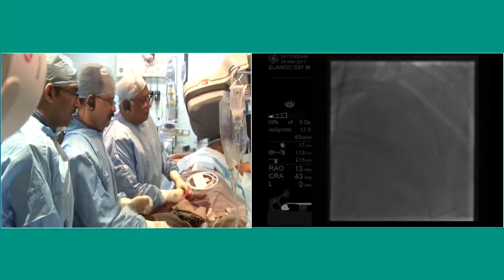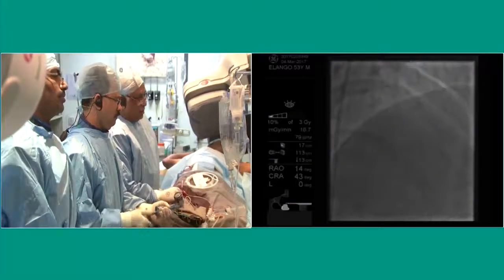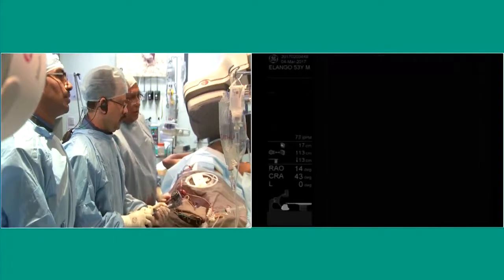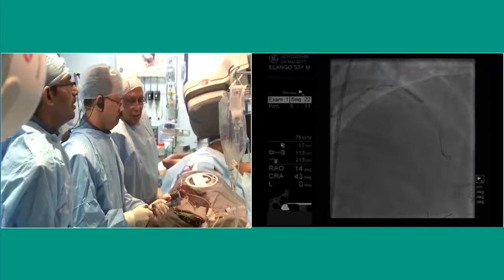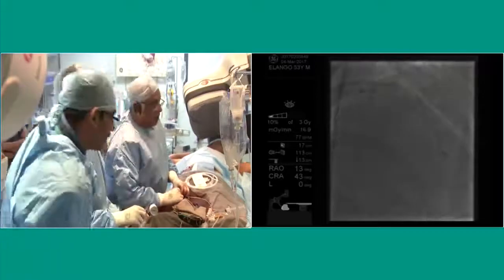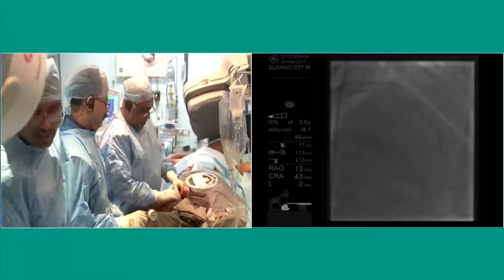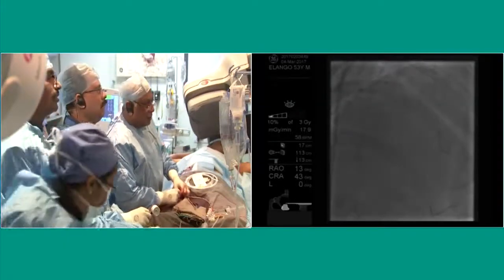Go up. 20, 24, 26. So never try to push an 18 stent, a 20 stent, into a 20 side branch, 24, when it is not going in smoothly. Negative. So I'll push the balloon back again. Push the balloon down. Yeah, okay. Now let me see what happens.